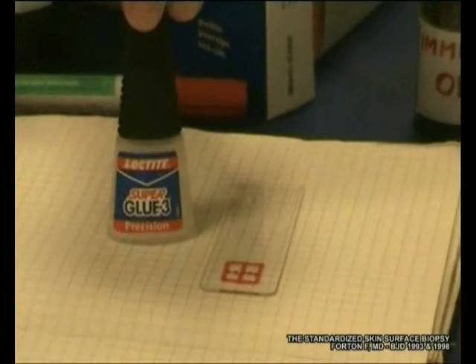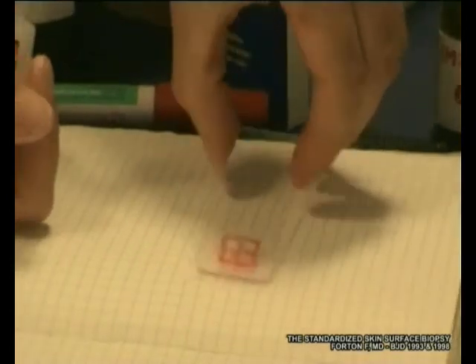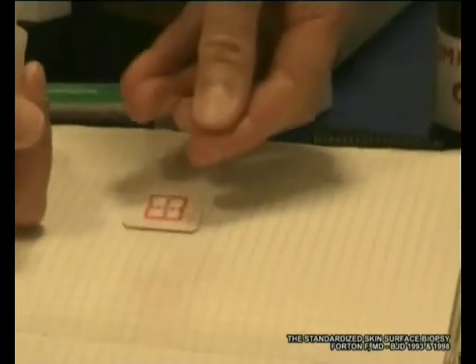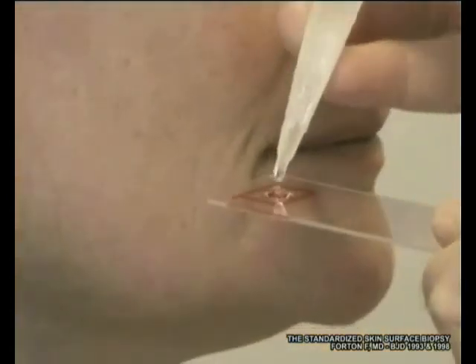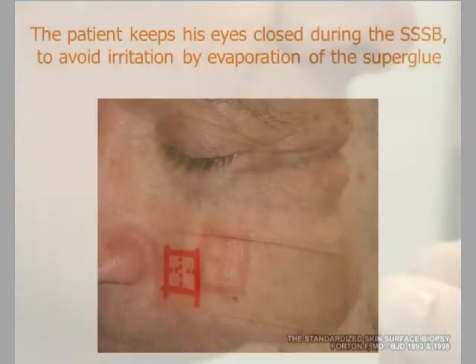Then we get cyanoacrylic adhesive superglue. We turn up the lamina, and on the other side we place one or two drops of cyanoacrylic adhesive on the slide, and we put it on the skin surface.